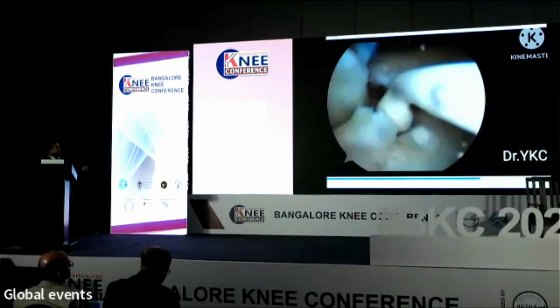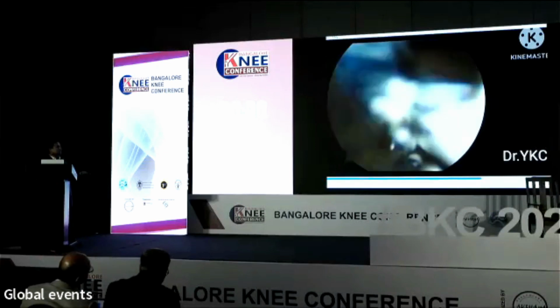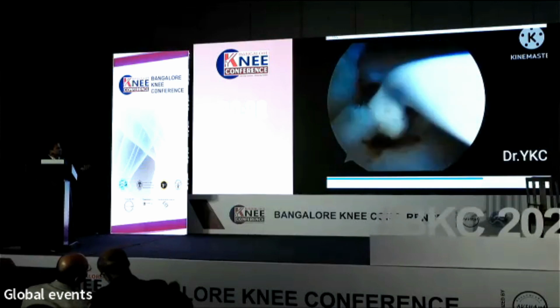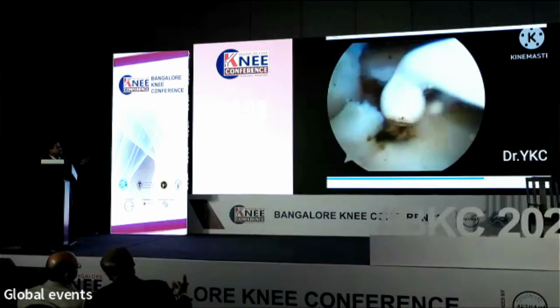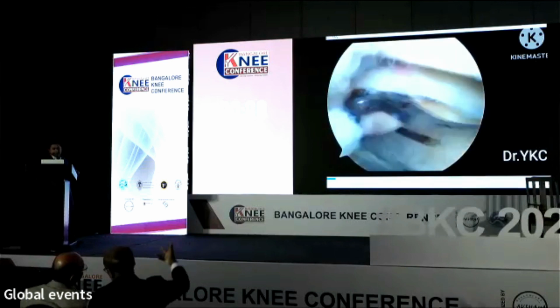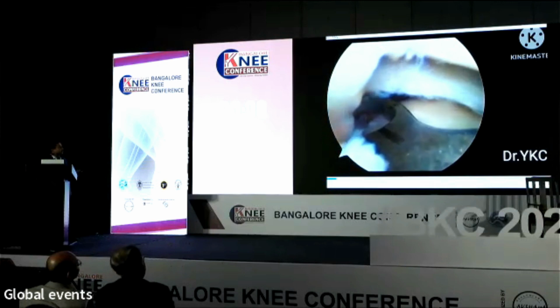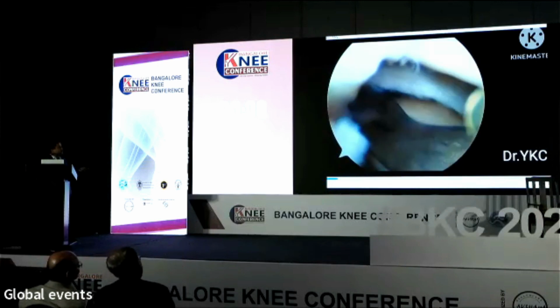So the gold standard treatment for meniscal root tear is the transtibial pull-out technique. Either you can use a single tunnel or two tunnel technique. Take the sutures through the posterior root and fix them to the anterior part of the tibia with cortical fixation, either using a button, or if you use the two tunnel technique, you need not use one.